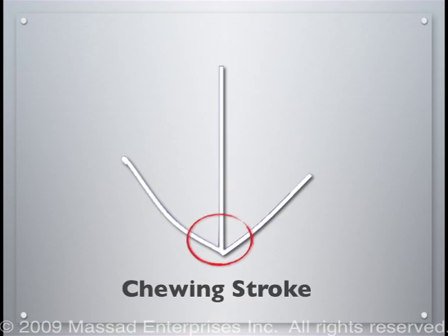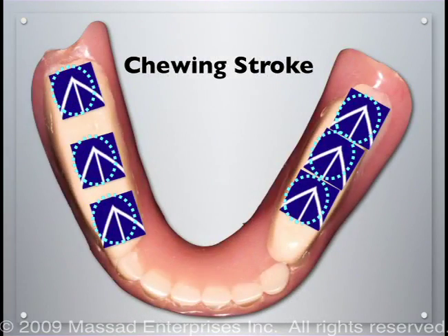The amount of eccentric movement will only be the amount of the buccolingual distance of the chewing surface. This is approximately 2 millimeters. As seen here, as the patient moves forward, back and side to side, the amount of chewing stroke is approximately 1 to 2 millimeters.